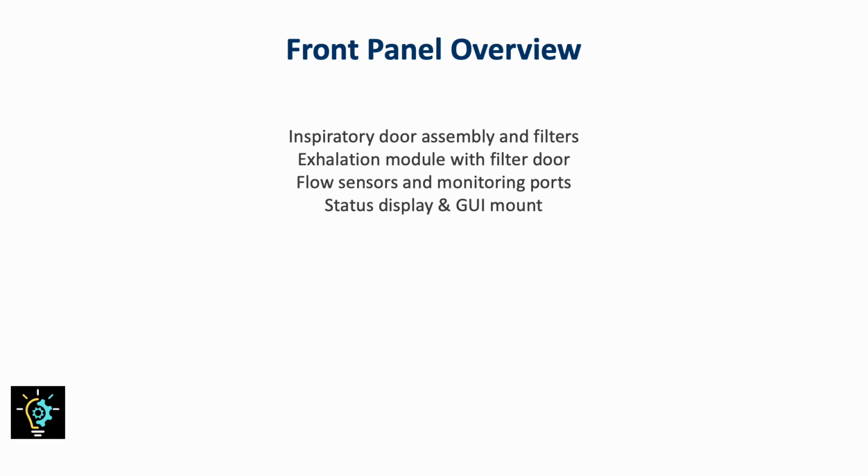Think of the front as the user side of the ventilator. It's where clinicians look for information first. As an engineer, you should also focus here, because many early signs of malfunction, like clogged filters or faulty sensors, will show up on this panel before anywhere else.